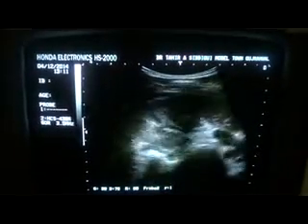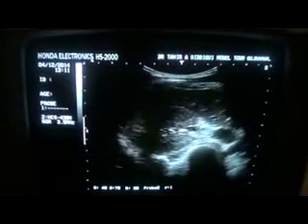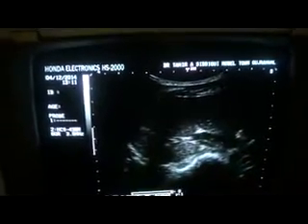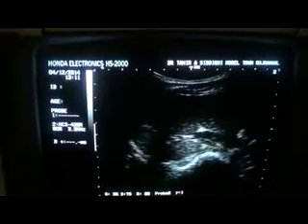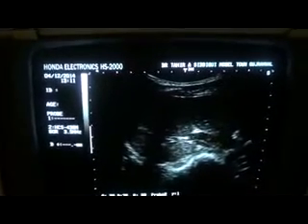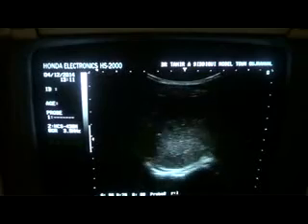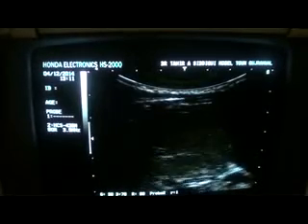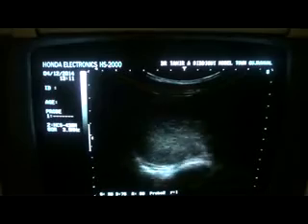And then I showed you in a transverse section that the renal artery, this is the renal artery, is patent. The right renal vein is of normal caliber, no clot or thrombus seen. And in transverse section, if I magnify a bit, no, let me keep it there.